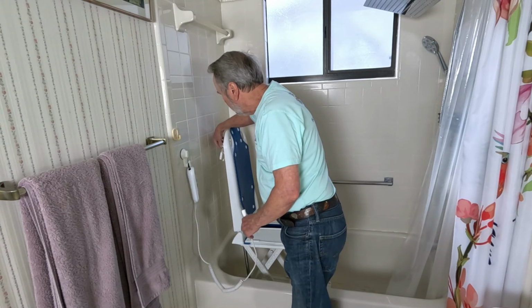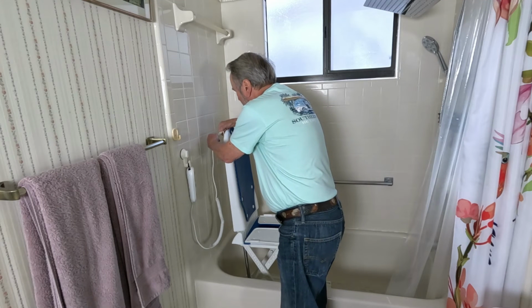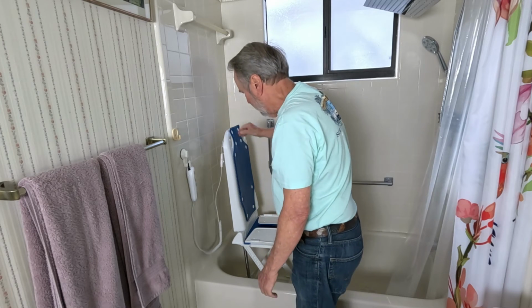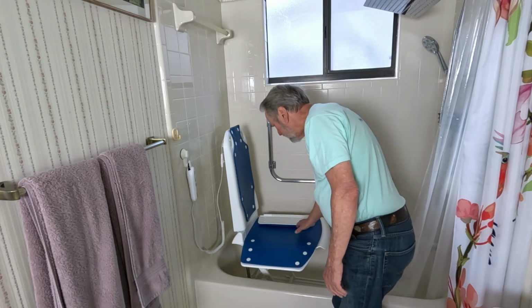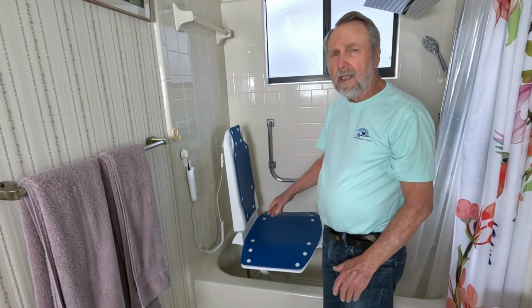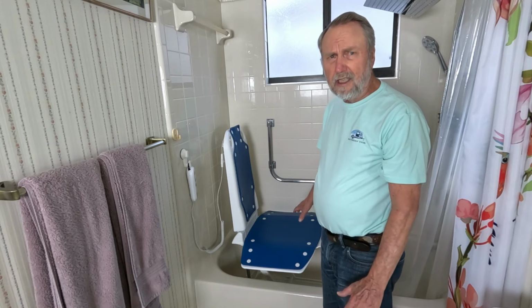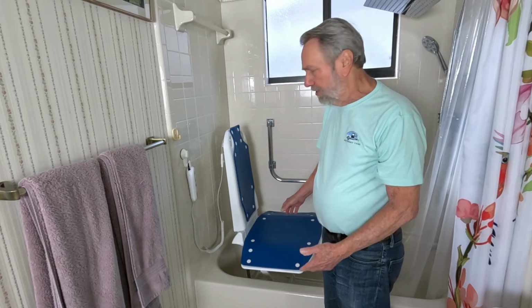And now we plug this in to here until it snaps. And there we go. And now it's ready, and then we put this. And this is something that the chair could stay in here, but the water should all be drained out and not sitting in water, only for the bath duration.